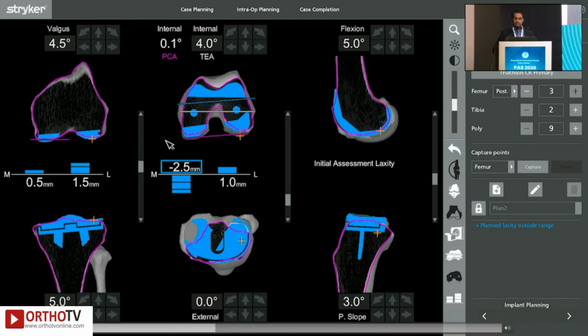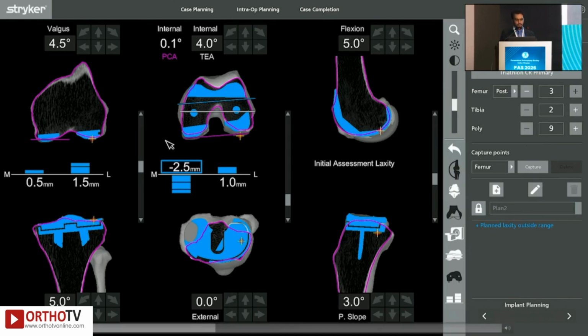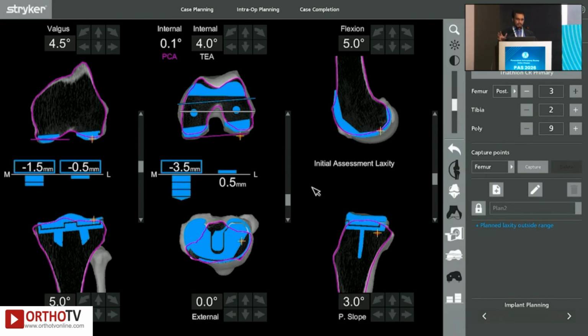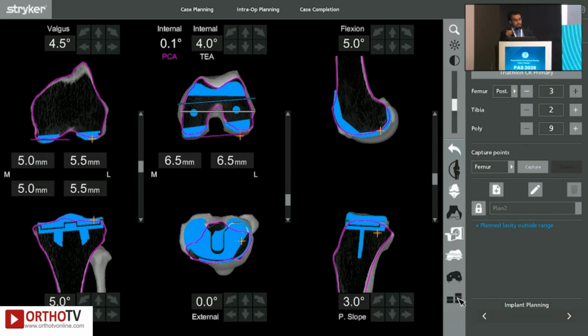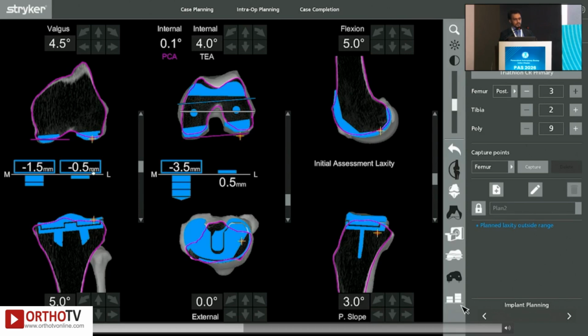And what are the movements? Since I have these cuts planned, I'm going to try and maintain it as kinematic as possible. That is, just resurface the femur and make all my adjustments in the tibia, but we are looking at a functional alignment, so I'm going to make some movements on the femur as well. So I start off by proximalizing the tibia, and I know I can't give any further varus because I'm already at my limit of 5. So I distalize my femur there to get the lateral side as close to 0 or minus 0.5.